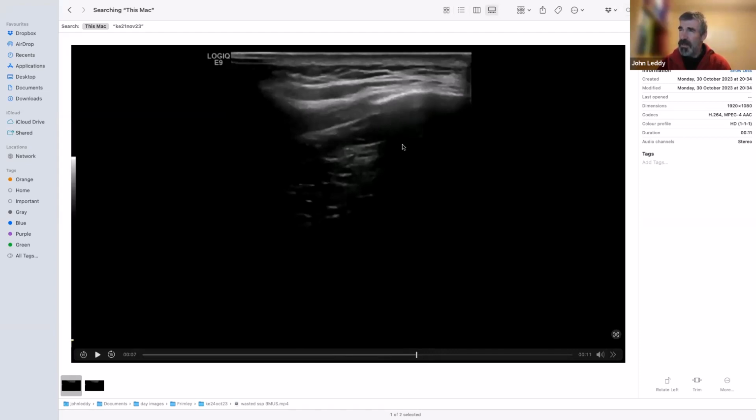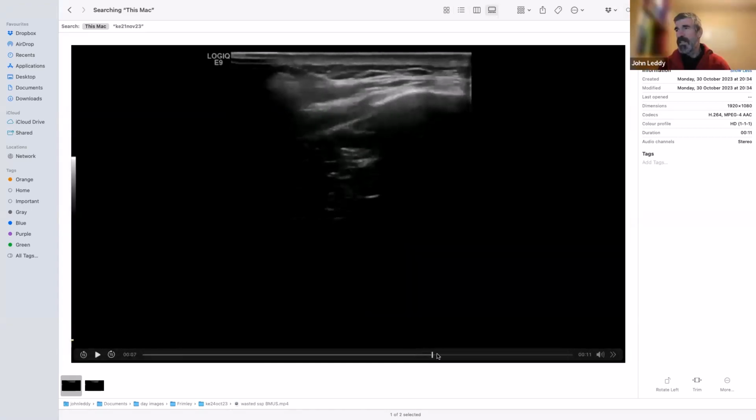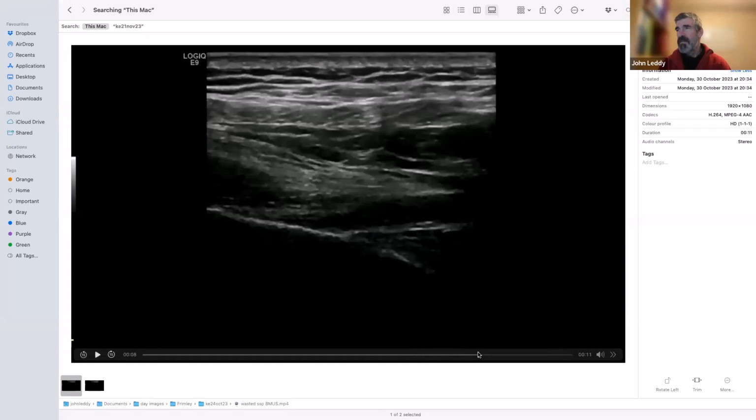Steve Bird describes the amount of fat you get here as being a marker of the degree of wasting. I don't necessarily think that's always quite so useful, but I do like it as a yardstick. You just go, that's a lot of fat compared to not a lot of muscle.